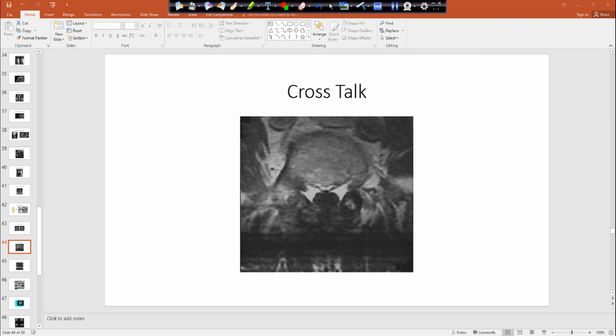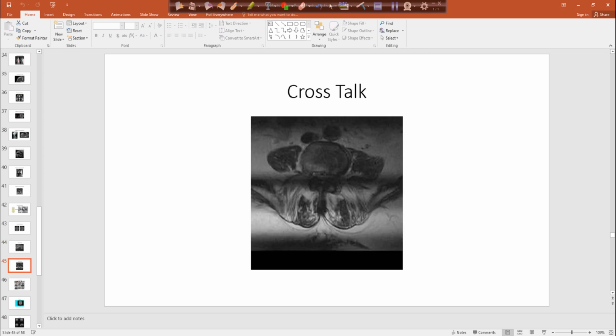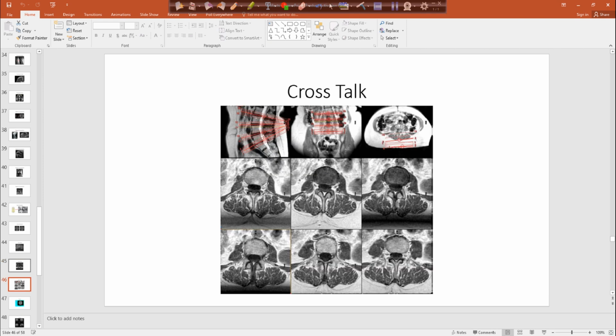So there's no remedy for this. If there's a question on it, there's no remedy. The only way to not have this artifact is not to position your slices on top of each other. Here's another one going through the spinal canal, definitely going to repeat that sequence.